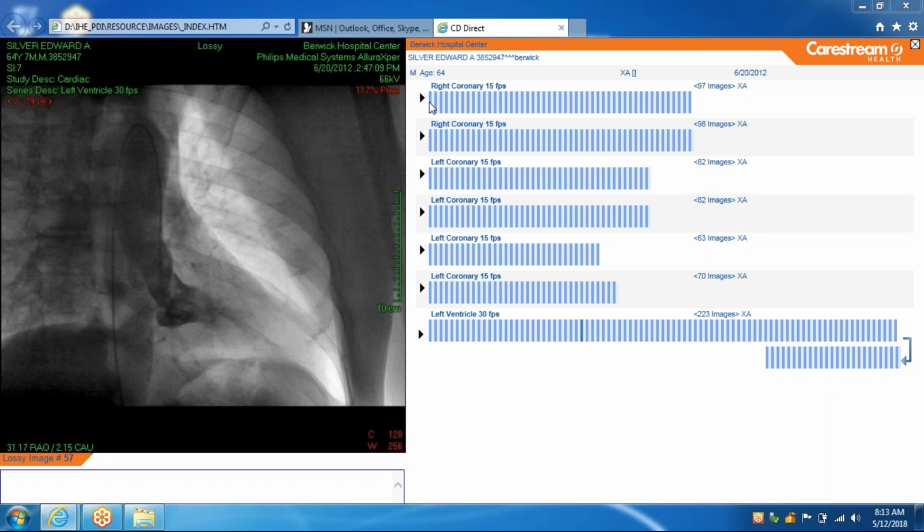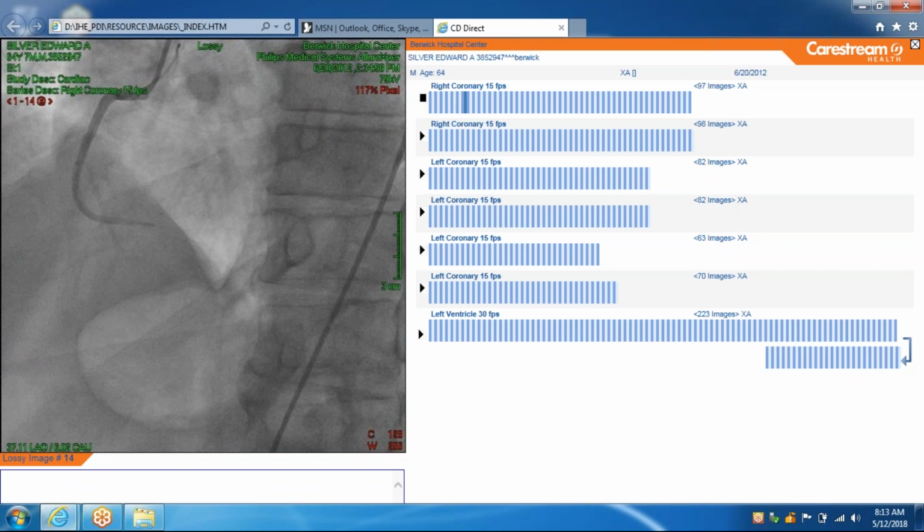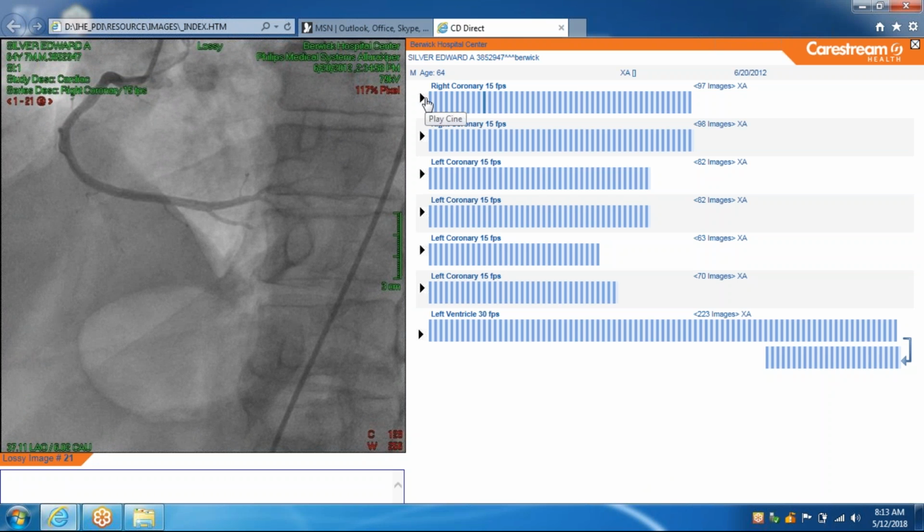So when we do our angiogram, we go up and we cannulate. So this is the right coronary artery. You can see our catheter. This is a femoral approach. We went from the femoral artery up into the aorta, the aortic arch, and the ascending aorta, and then we get to the coronary cusp. To get the right coronary artery, we get to the right coronary cusp and then cannulate the right coronary artery.